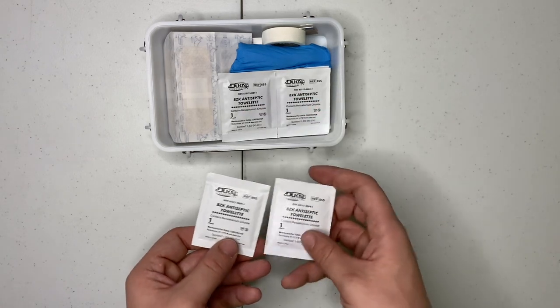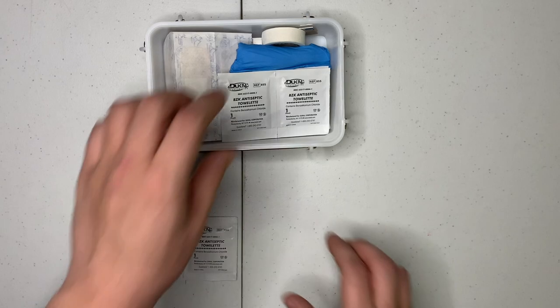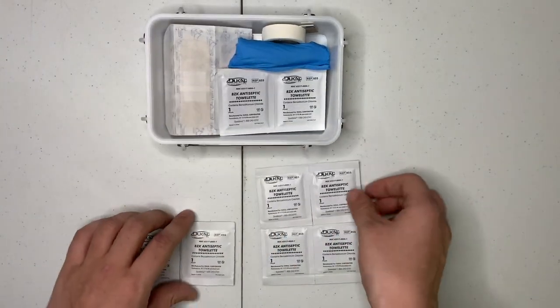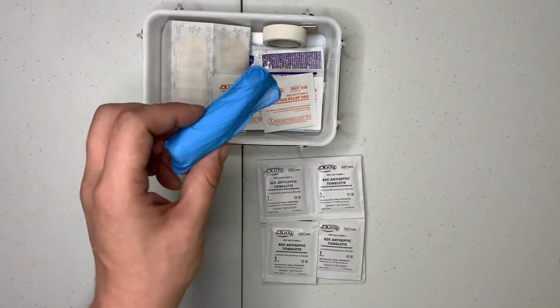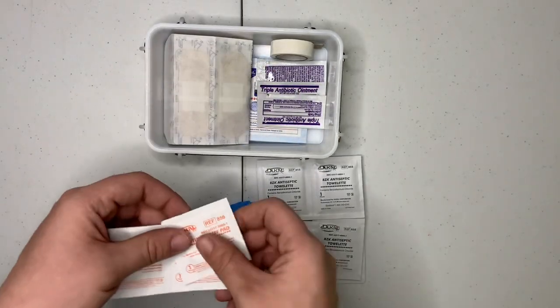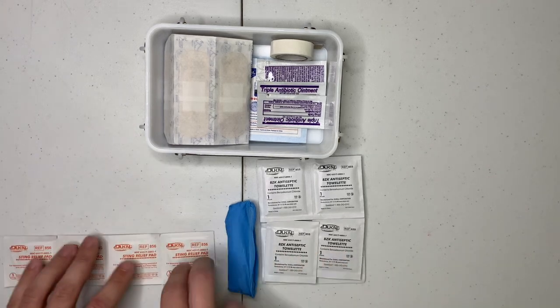We got our antiseptic towelettes. More antiseptic towelettes. That's a good amount right there, so you get four antiseptic towelettes, gloves, and four sting relief pads.